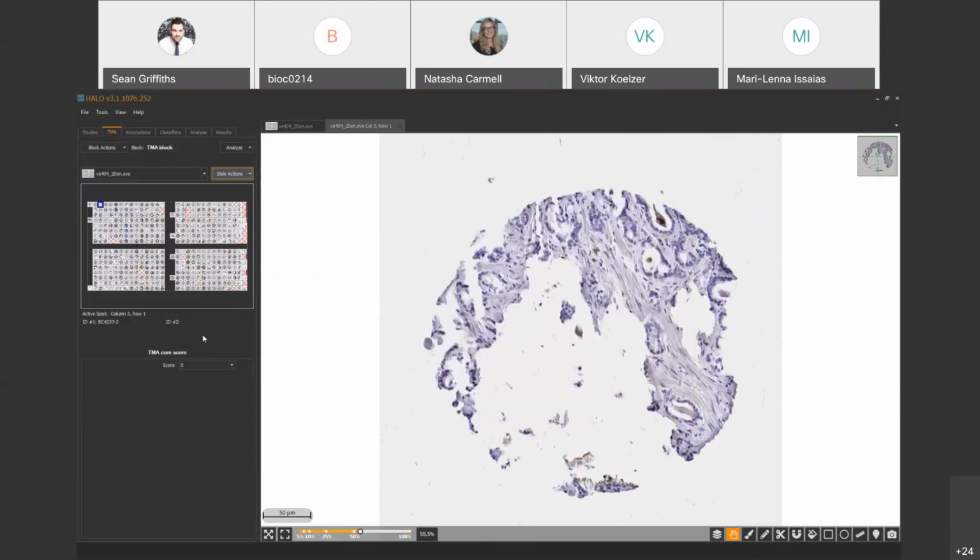Okay, so they're almost the side dishes. The real exciting thing we're going to do is run analysis across the array. If you were to select all cores, or maybe a selection such as this, select analyze and hit selected spots. Okay, so it's going to say 3 spots were invalid and will not be included in the analysis. It will load 111 spots into the batch processing queue, and then it'll perform some analysis.